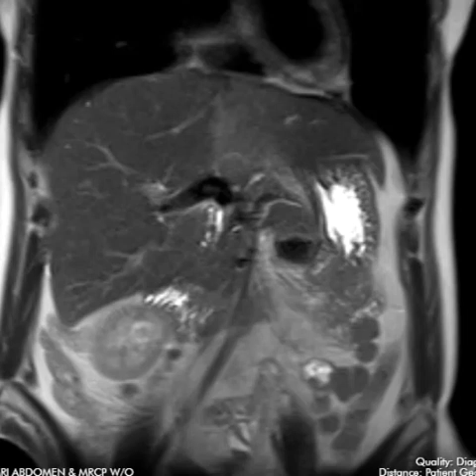Hello, this is Dr. Gay from First Look MRI, and this is a patient who is 40 years old. She complains of abdominal pain, nausea, bloating. Symptoms seem to be worse after meals, and she's had the symptoms for quite some time, I think a couple of years, and she called to order an MRI, and I just happened to pick up the phone and talk to her and learned about her symptoms.